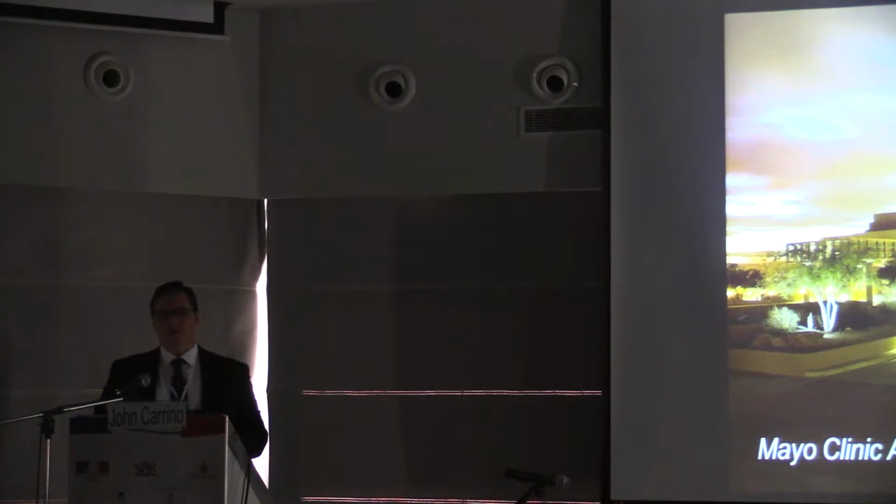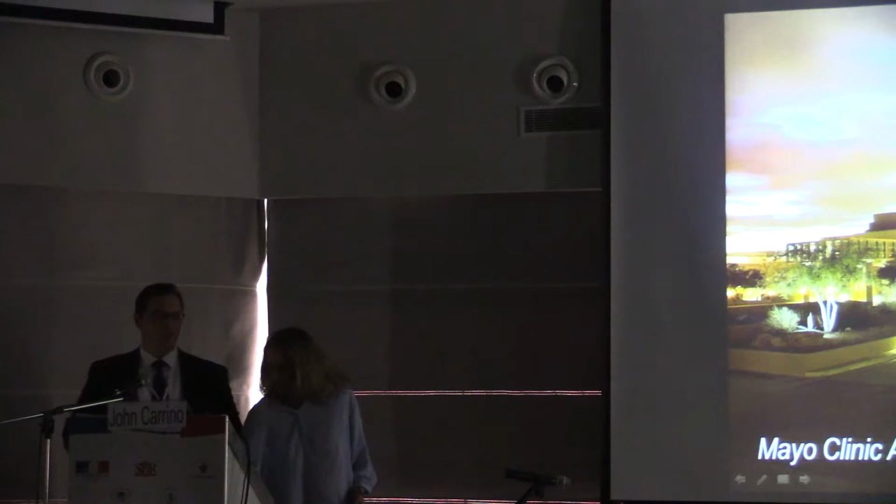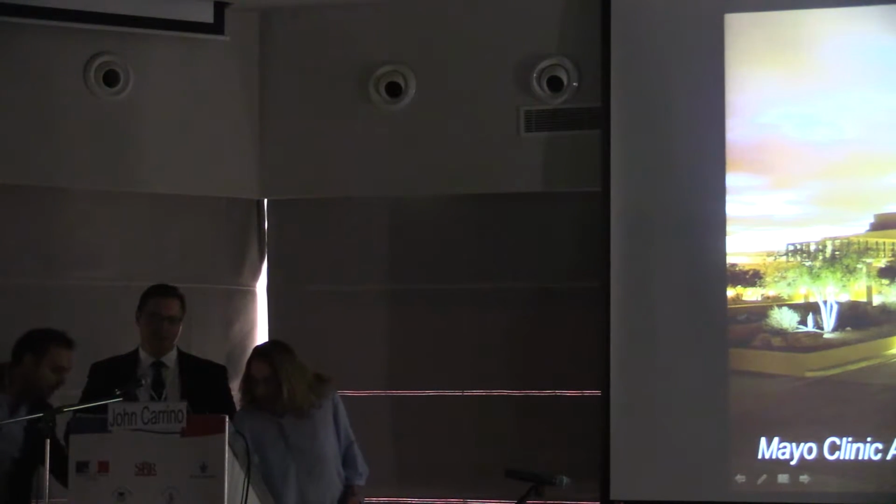What I like about giving this talk to a very broad audience is that you may read spine MRI if you're a musculoskeletal radiologist like myself, if you're a neuroradiologist, or very commonly as a general radiologist. So I think this talk has very broad appeal, and really the reason for giving it was I was tired of people saying that spine MRI is useless.